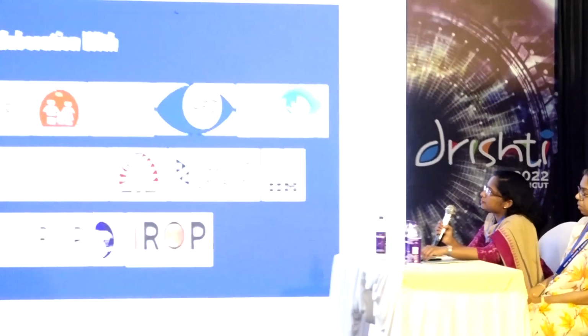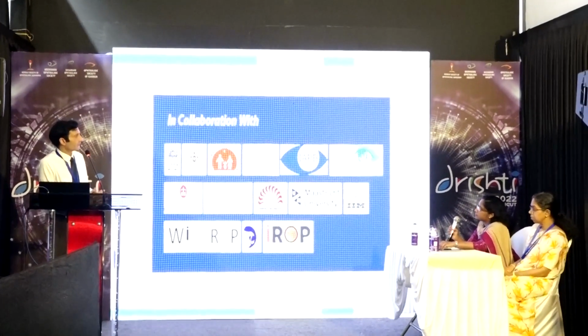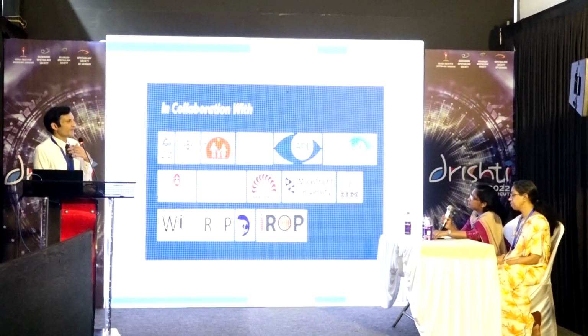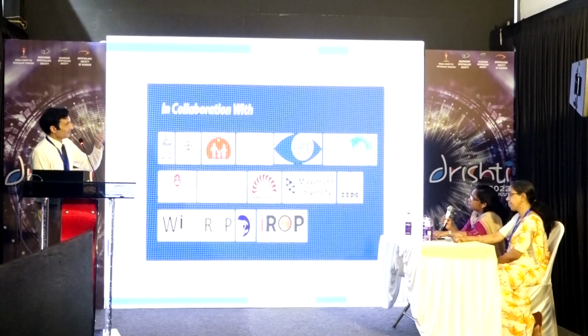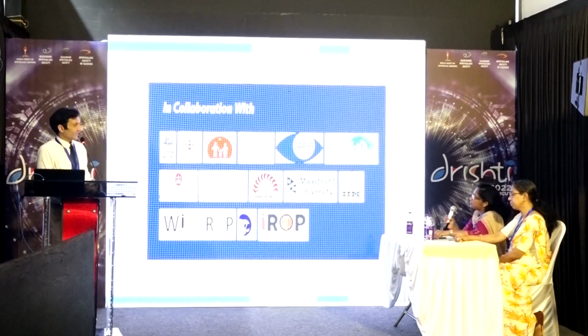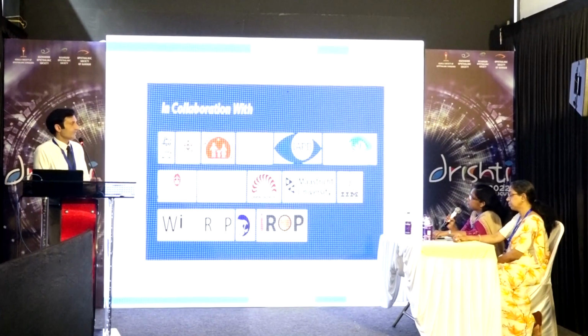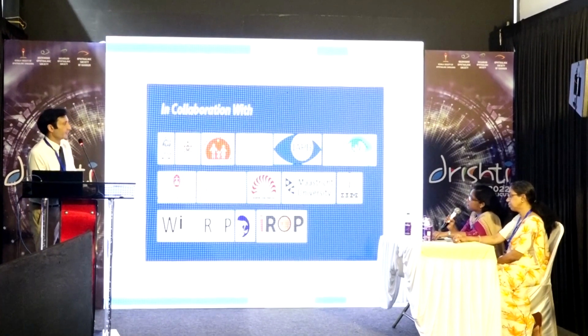Any special cases where you prefer doing an angio, or do you do it in all cases? We are now doing it for almost all cases of aggressive ROP. We try to do it if injection is our plan of management. We try to do the angiogram a day before because we feel somehow we are contaminating the field by running the camera over the eye. So we do it a day before and then take the baby into the OT straight away on the day we are giving the injection, or a day later.